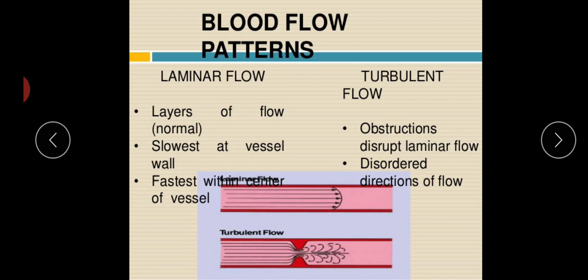Specular reflection implies a nice smooth surface. The wall of the blood vessel is relatively smooth, whereas the red cells are not continuous and act as rough surfaces. Ultrasound encountering blood is not reflected, it is scattered in all directions. And this scattering is referred to as Rayleigh-Tyndall scattering.